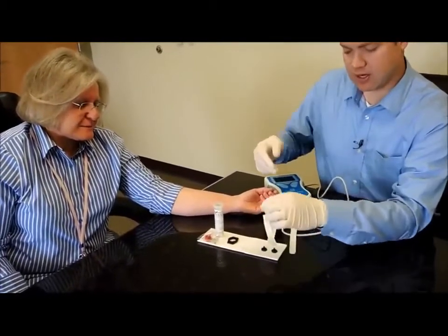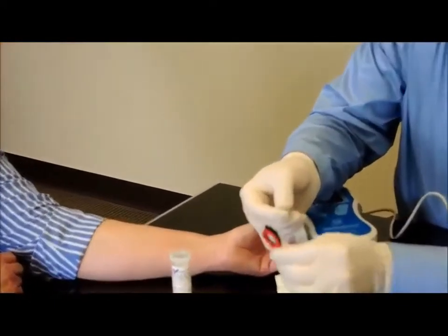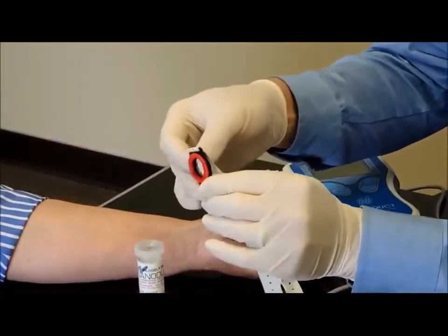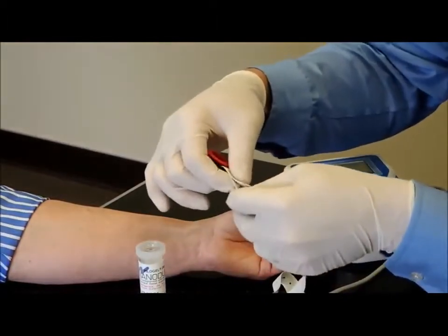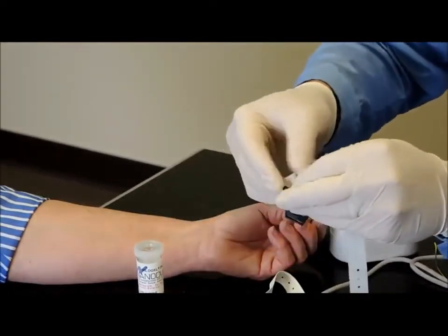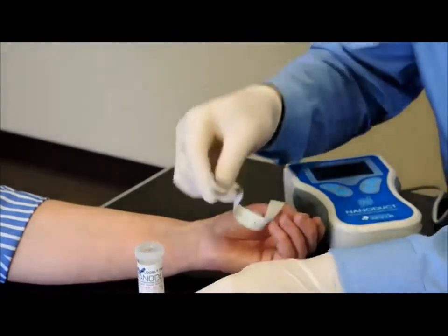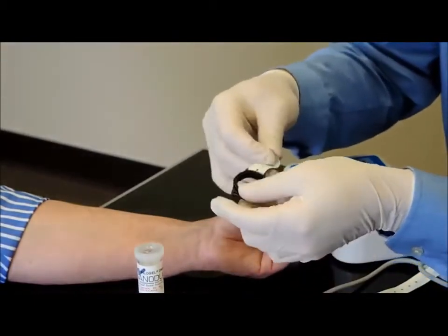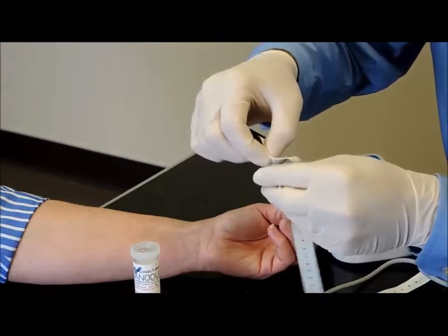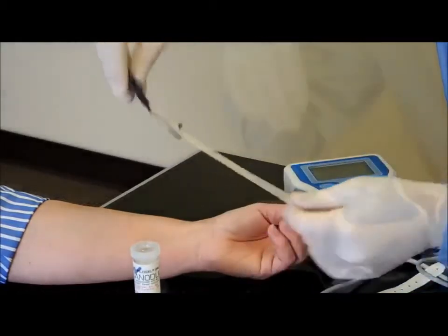The first thing you want to do is connect the holders to the strap. You do that by running one end of the strap through the connector, and then you run it through so there's a few holes in between, and you take the post and put it through like that. And we do that on both the red and the black holders. Line up the holes and put a post through the rubberized straps, like so. Okay?